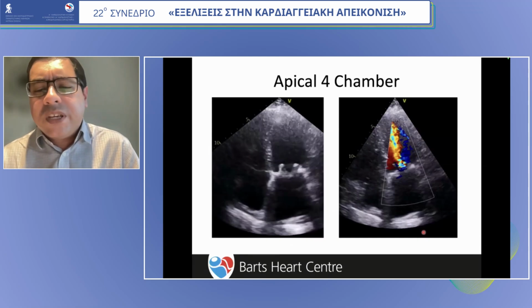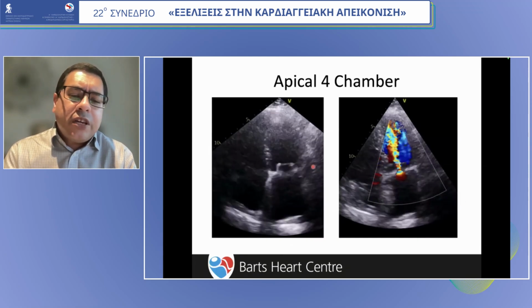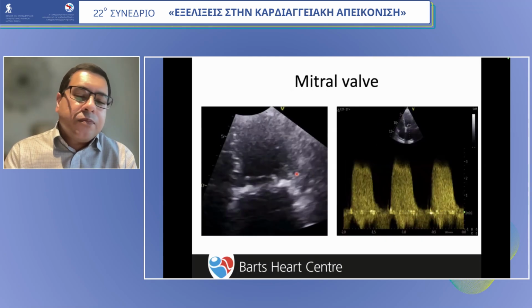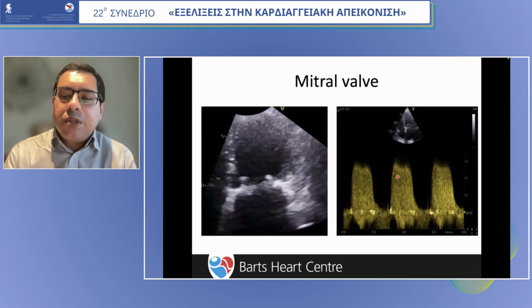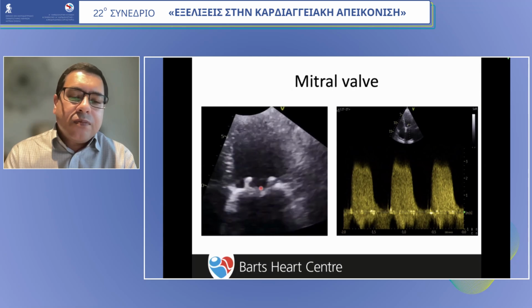This is the transthoracic when they came into the accident and emergency room. We can see there's flow acceleration, and we see a thickening of the valve leaflets, which I think we've got a zoom of here. Okay, so we see elevated gradients, almost 3 meters per second. We see grossly thickened valve leaflets and very little motion of them.